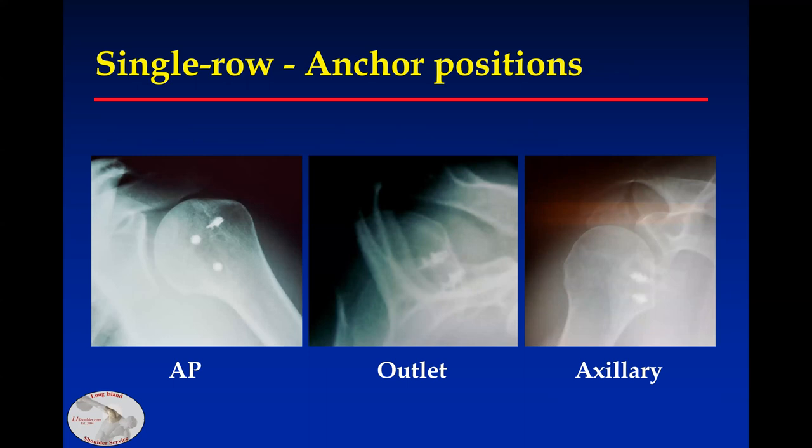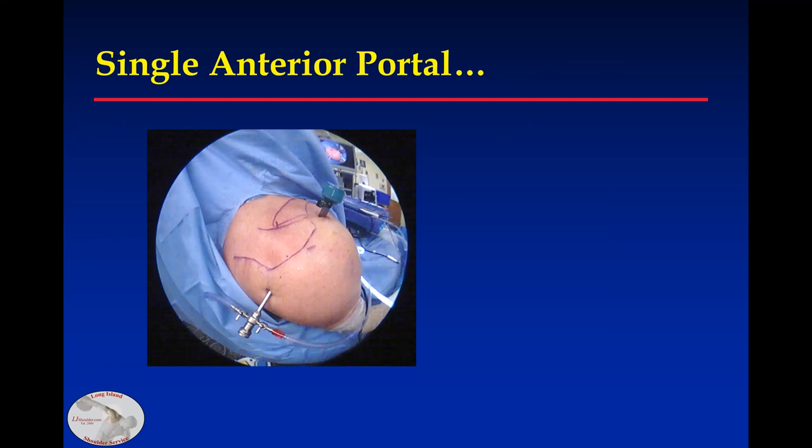When I used metal anchors, this showed well where they should be. I'd also like to show some techniques using a single anterior portal, because it's not always easy to get a second cannula in.